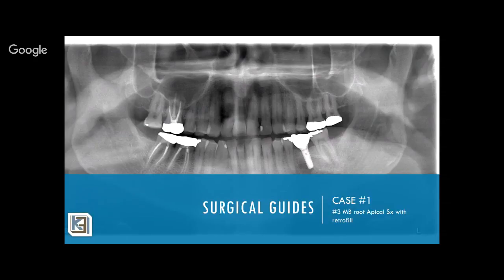Just think of the CT scan exposure as if it's a regular X-ray. So you increase your kVp, you decrease your milliamps, and if you have an HD or high definition setting on the machine, then use the HD setting. Now, for endo purposes, we would prefer to use the smallest field possible. That will give you the highest definition possible.